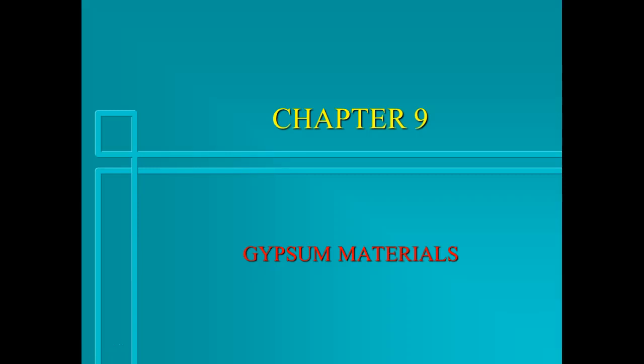This is Chapter 9, Gypsum Materials. Gypsum products are used mainly for positive reproductions or replicas of oral structures. Gypsum materials are used in dental offices and laboratories by dentists, hygienists, assistants, and lab technicians.